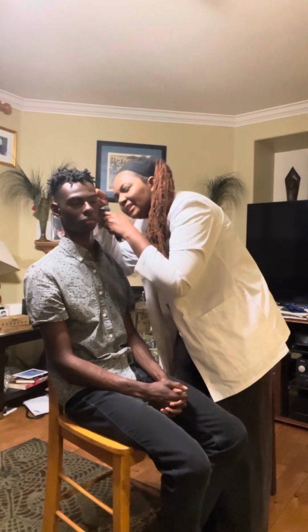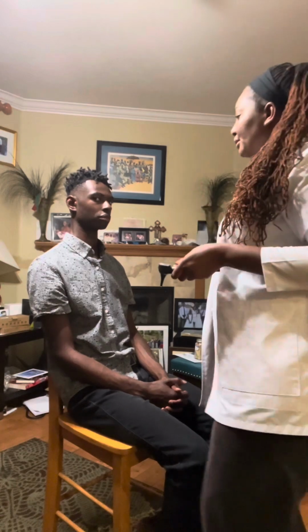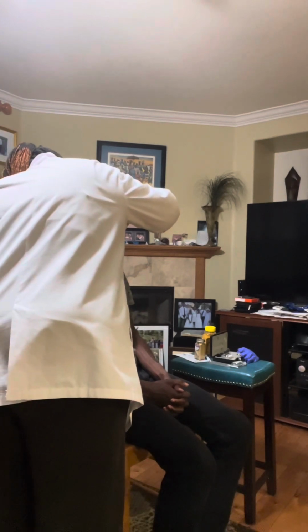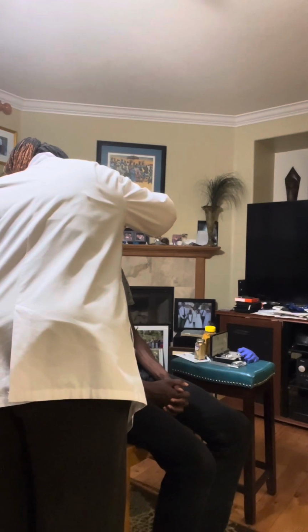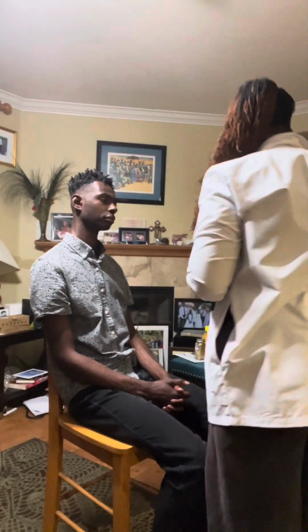Okay, and I'm going to go to the left ear since this camera is in selfie mode. So this is the left ear. Okay, and I'm going to go to 7 o'clock, and the tympanic membrane is fairly gray, and there is no erythema, there is no sign of infection, there is no drainage. Do you have any pain in your ears? No. Okay.